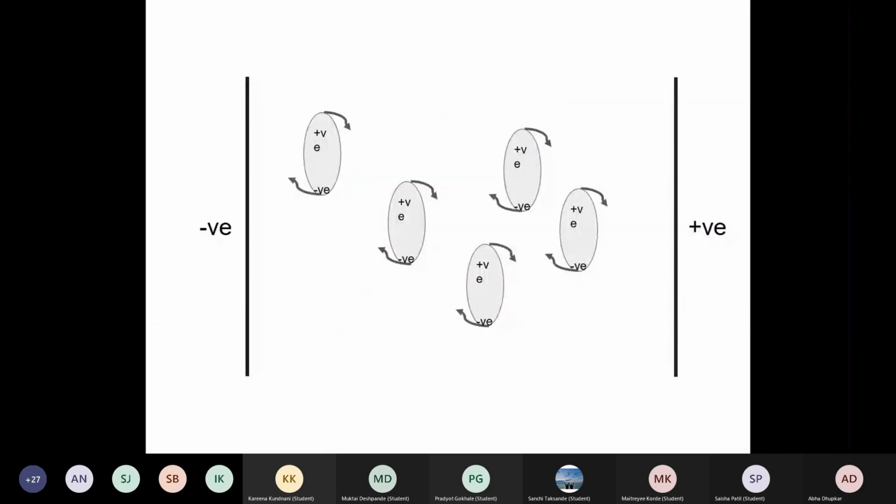The second thing that you have is the dipole rotation. Every time you get a negative charge, the dipole is going to rotate. The positive pole is going to move towards the negative side, and the negative is going to move away from the negative charge. Again, this is going to be in contact with the surrounding structures. Therefore, you are going to get collision and heat production again, right?